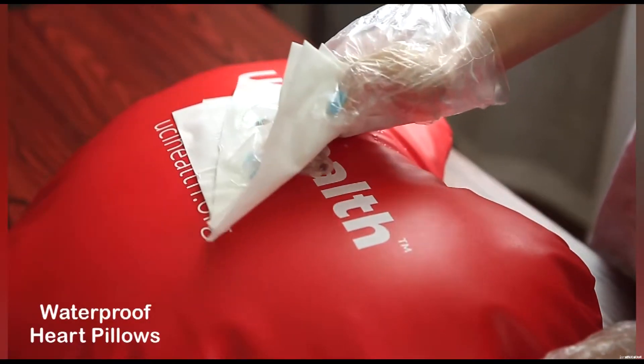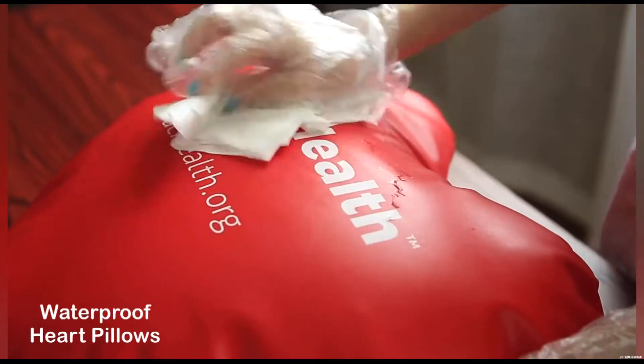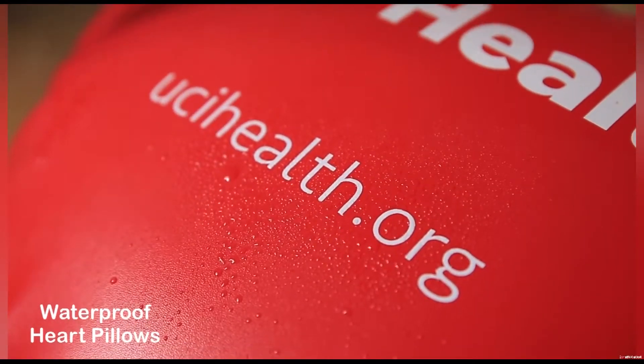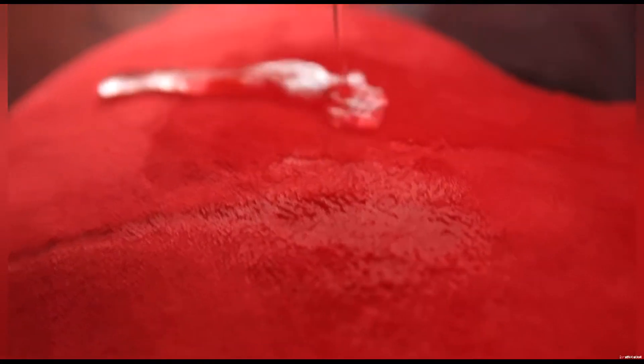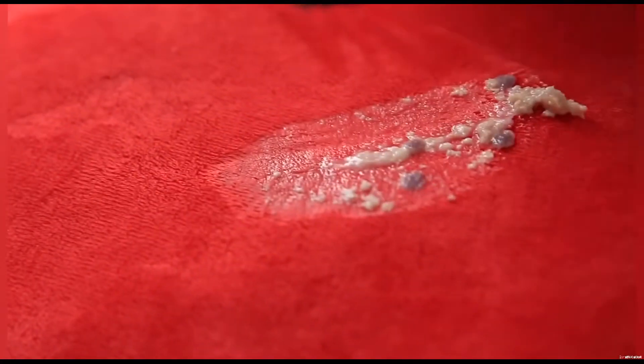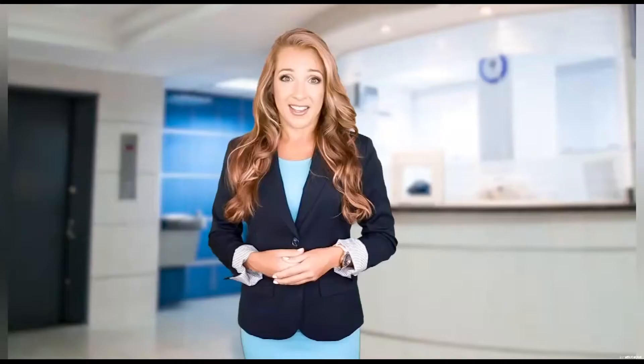To clean it for instant safe reuse, wipe and rub it with a cloth, then spray it with disinfectant. No backup pillows needed! When the cloth pillow gets spilled on, the liquid and germs leave irreversible stains on the rough surface, seeping through the porous fabric and settling inside forever. Will you wash the pillow or trash it?